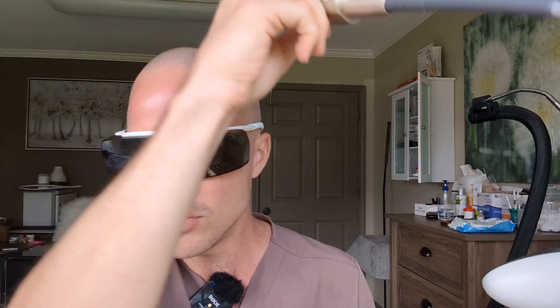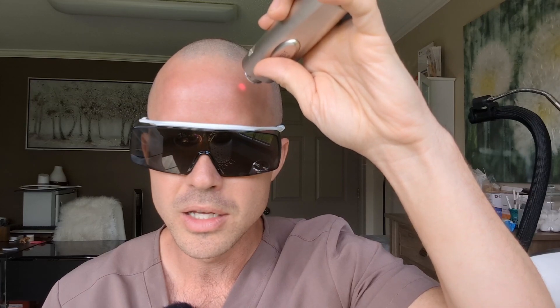If you go on PubMed and look up radiofrequency microneedling compared to short-pulsed Nd:YAG treatments, what you'll see is that the effects are comparable. The discomfort depends on which radiofrequency microneedling device you're using, but the discomfort is not worse than radiofrequency microneedling. You don't get this sort of electric shock that causes the muscles to spasm with this, that you do get with radiofrequency microneedling. The pure sensation of a little bit of heat is actually pretty comparable, but with numbing it is extremely, extremely tolerable.